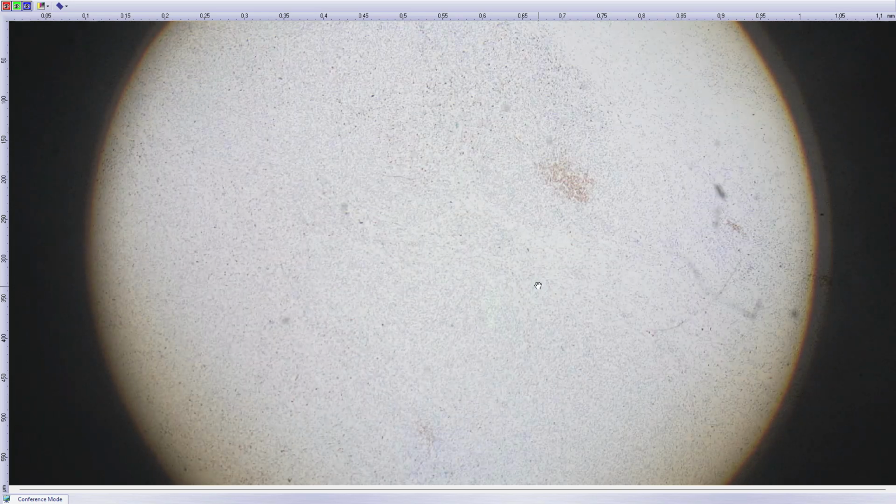Yeah. So CD35, another follicular dendritic cell marker, and finally we have some decent positivity here. This is already pretty good. Diffuse, or multifocal but strong, not diffuse.